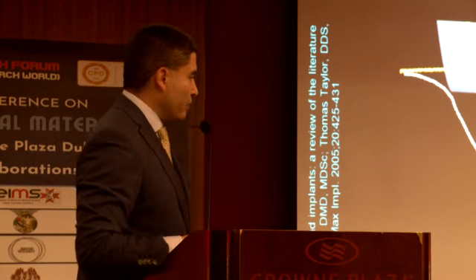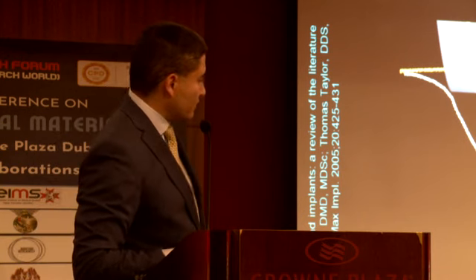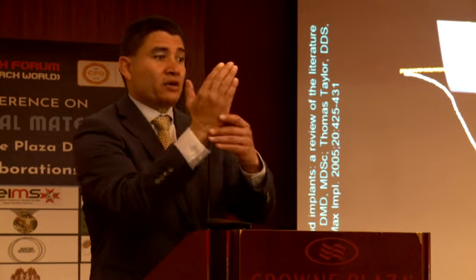What that means for us, you mentioned it earlier today, is that the primary stability of an implant is given for the first 48 hours. What does that mean? That means that if you don't do immediate loading in 48 hours, the stability of your implant decreases.